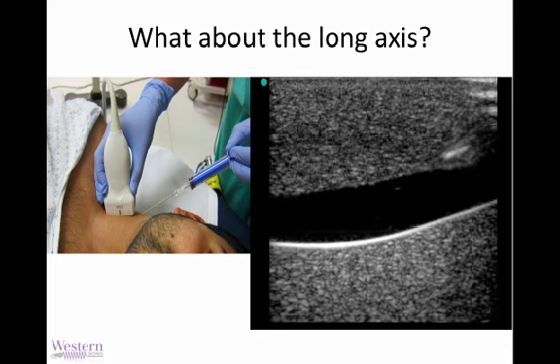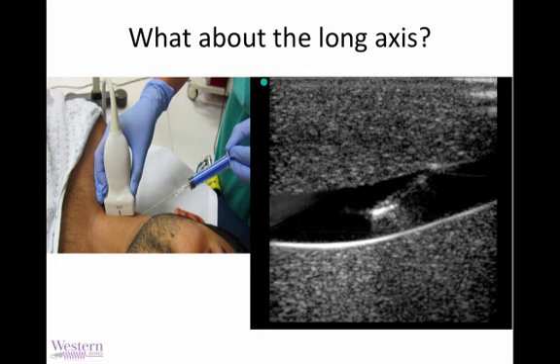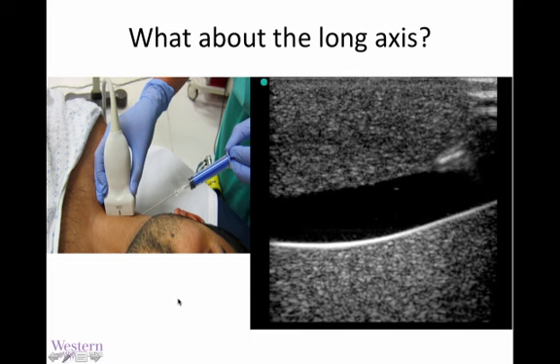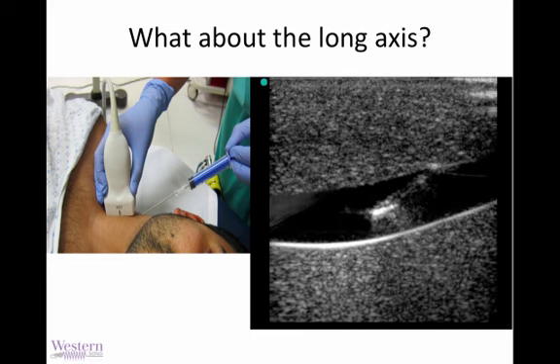Beautiful. So let's talk about long axis approach. Everyone loves the long axis approach. I mean, look how pretty that is, watching that needle go into the phantom vessel there. You can see the needle the whole way. None of this creep technique. It looks so awesome. It's great. But the question, of course, I have for you is, where's the other vessel? Where's the carotid that we're trying to avoid? I mean, remember, the very point, or one of the major points of ultrasound guidance, is to avoid the carotid.